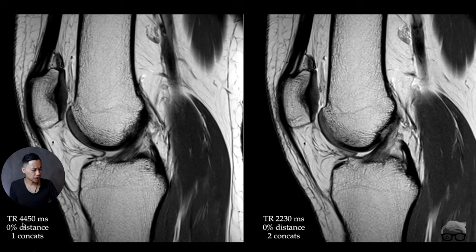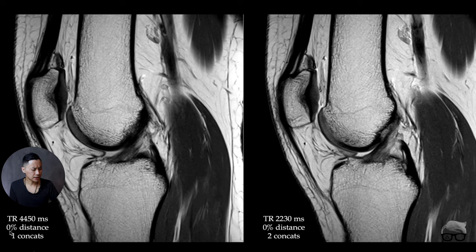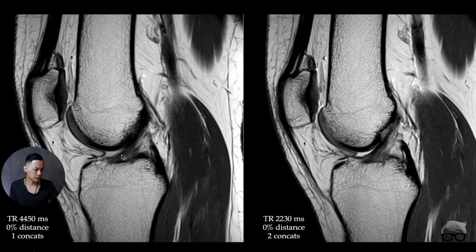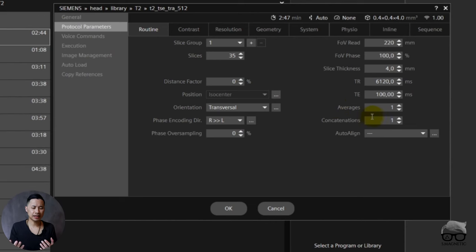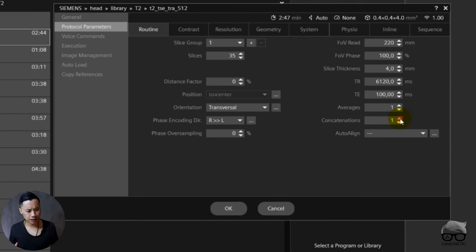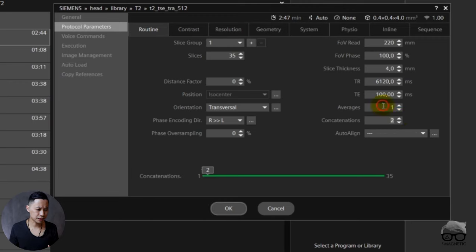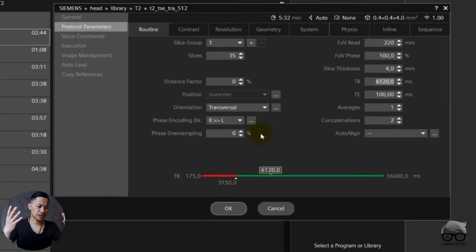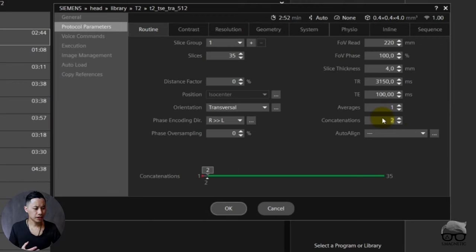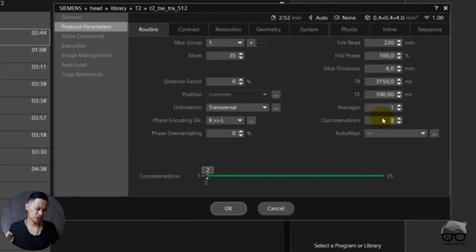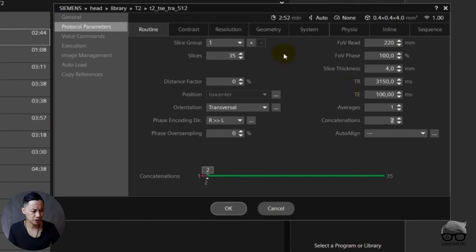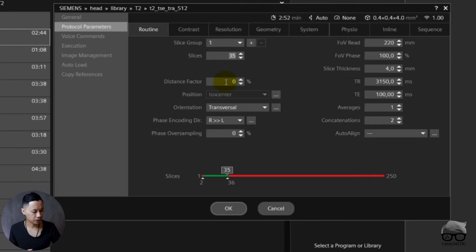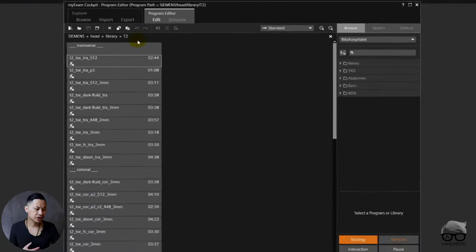Let's check this out. We have a TR of 4450 and this is half of it. But we have one concat, zero distance, two concat, zero distance. Look at the fluid, you get this kind of artifact. Let's go back to the scanner. It's exactly like I told you, right? Zero distance, two concats. Scan time increases, but now you can decrease the TR to get the scan time low and you still have T2-weighting, so don't worry about that. You're within that range. So now you won't suffer from crosstalk artifact.